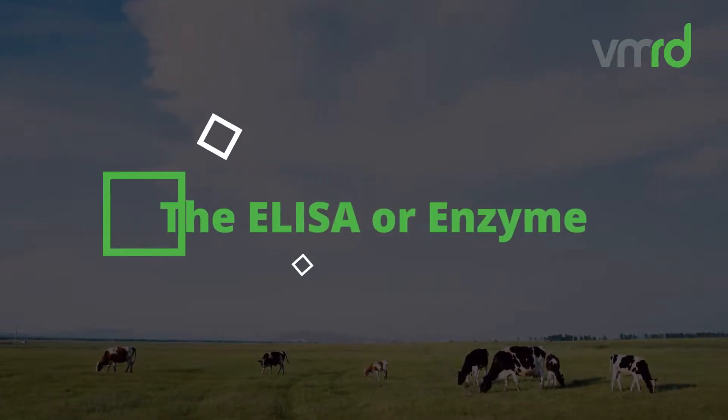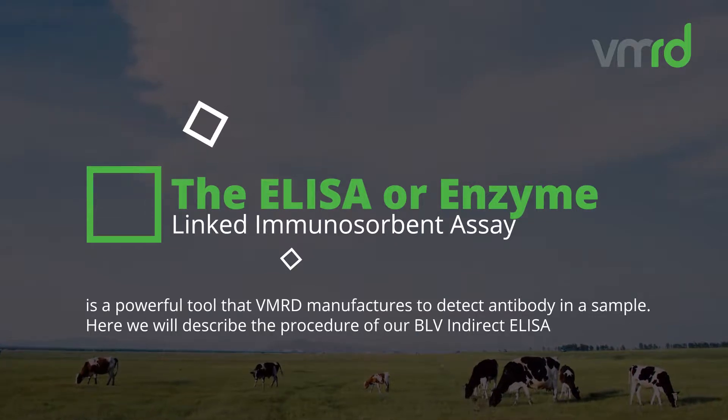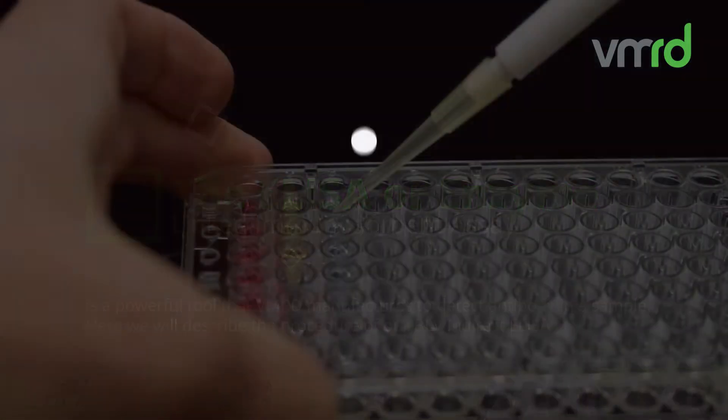The ELISA, or Enzyme-Linked Immunosorbent Assay, is a powerful tool that VMRD manufactures to detect antibody in a sample. Here we will describe the procedure of our BLV indirect ELISA.